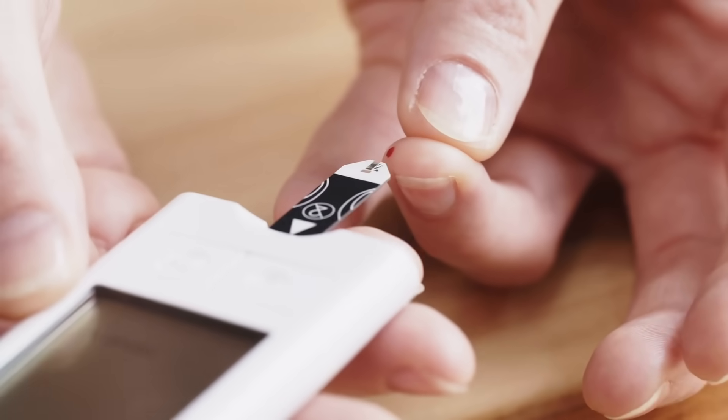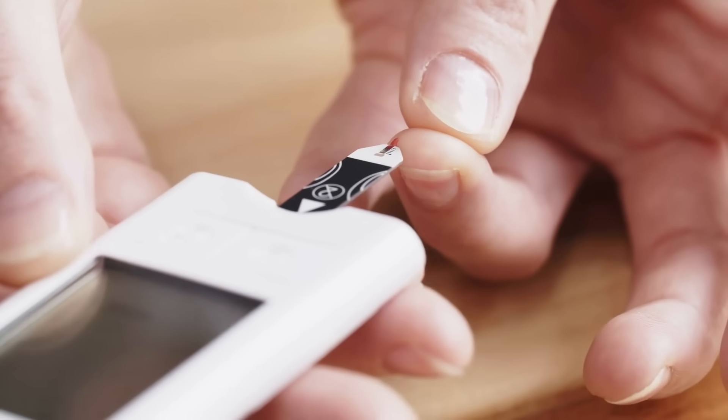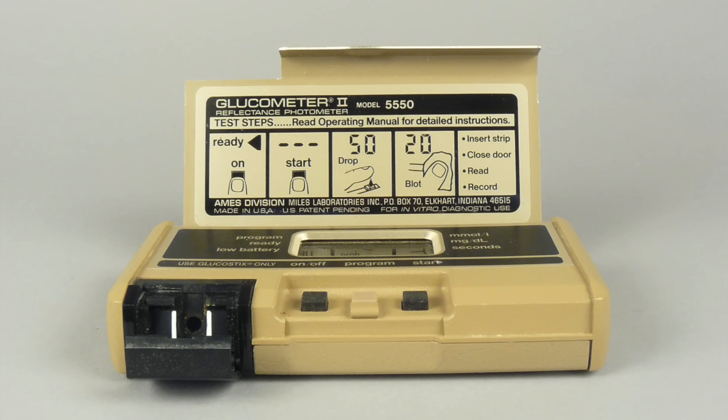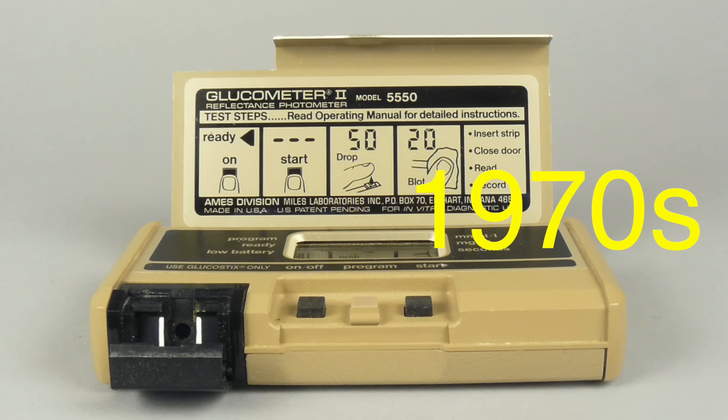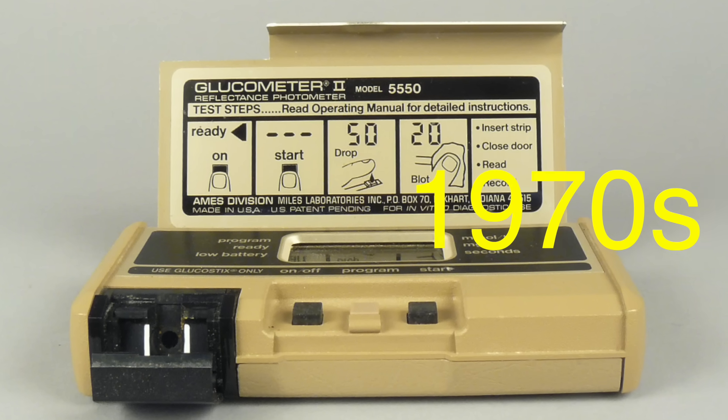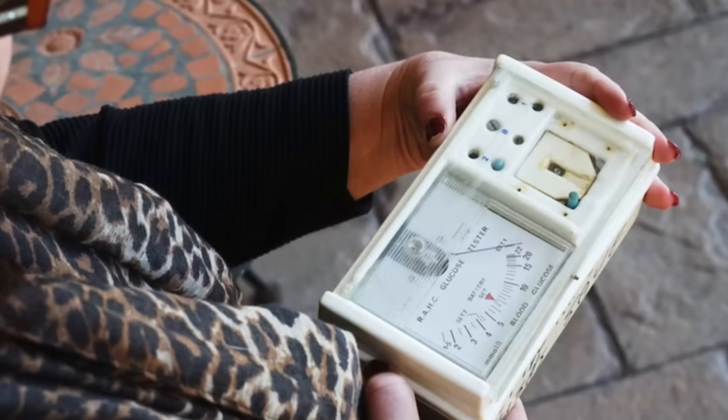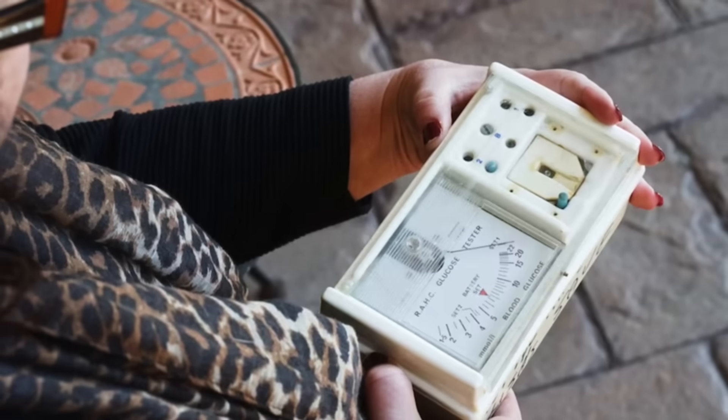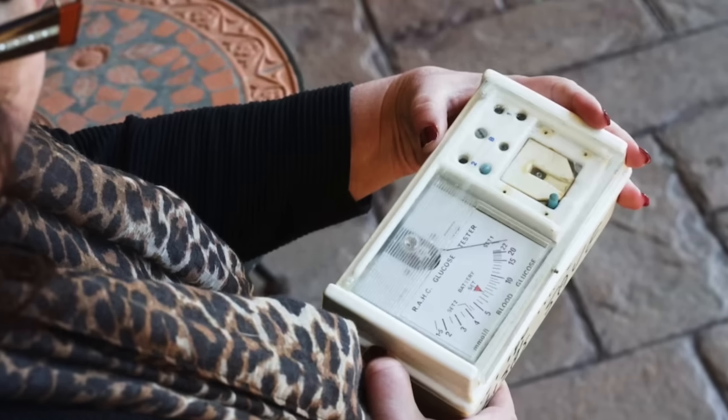Modern glucose meters are the result of decades of innovation. The earliest devices, developed in the 1970s, were bulky and required a lot of blood. They were slow, taking several minutes to provide a reading. Thankfully, technology has come a long way.